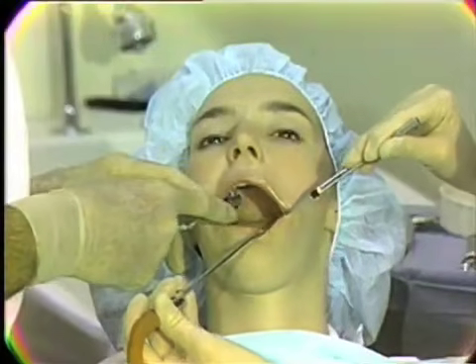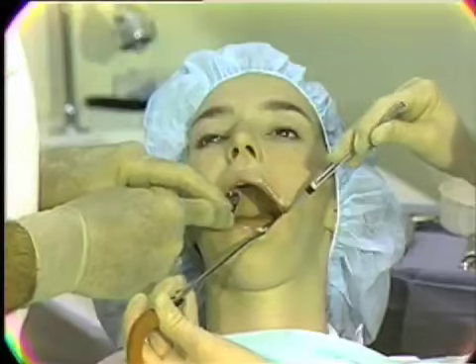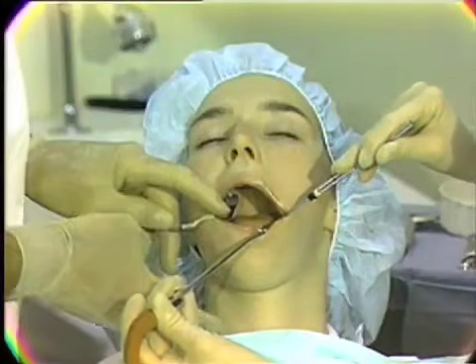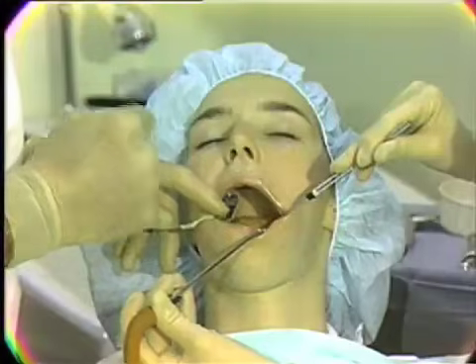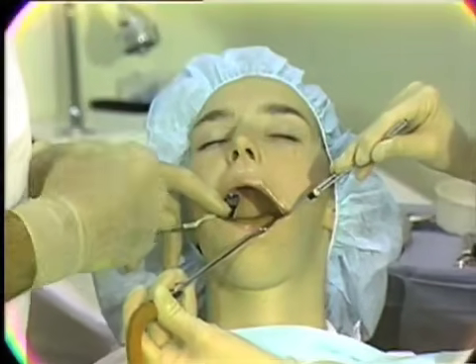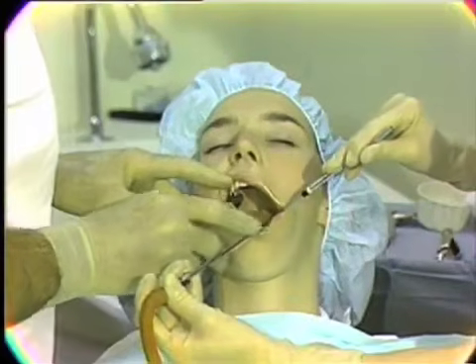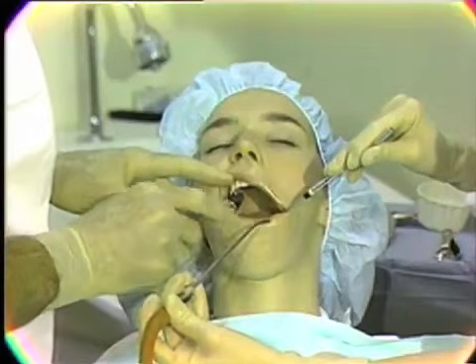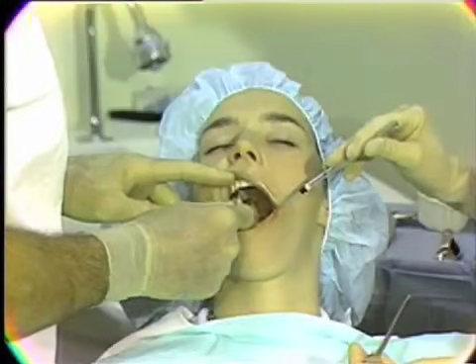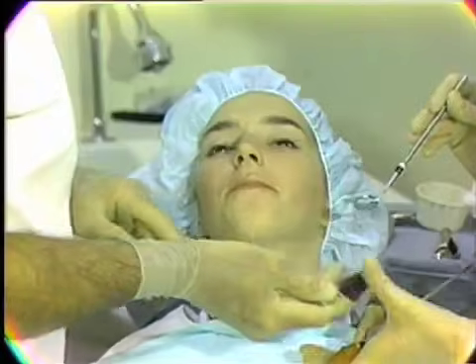In connection with the use of the rubber bite block, it's well to keep in mind that intermittently the patient can bite down and, by using the elevators of the mandible, firmly support the jaw so that you move the tooth and not the jaw. However, this position, if maintained for a protracted period of time, is uncomfortable. Muscles will go into spasm, so intermittently the prop should be removed and the patient allowed to close.